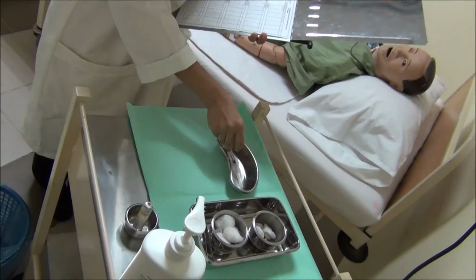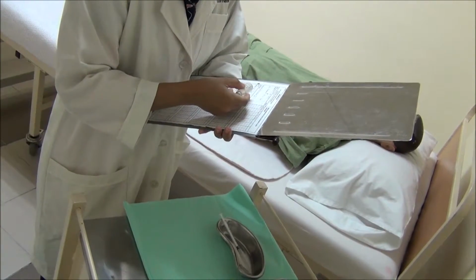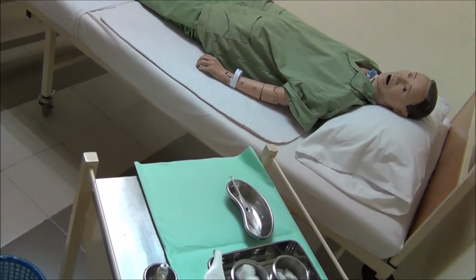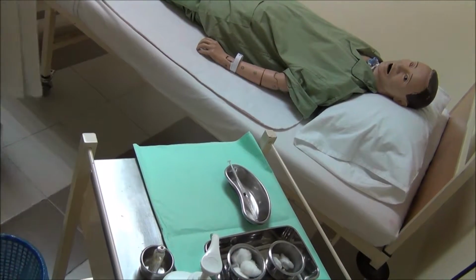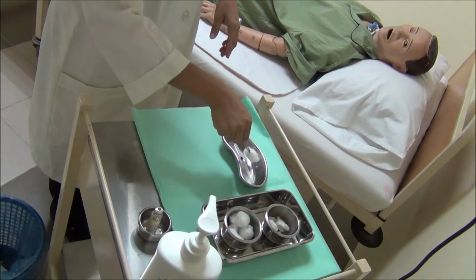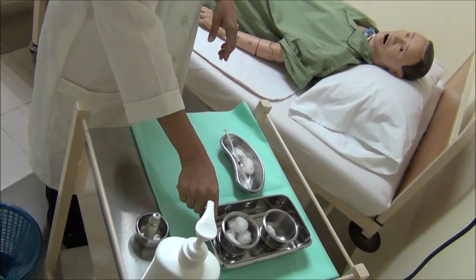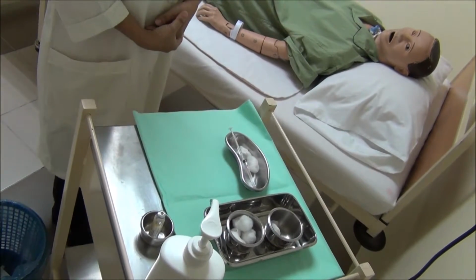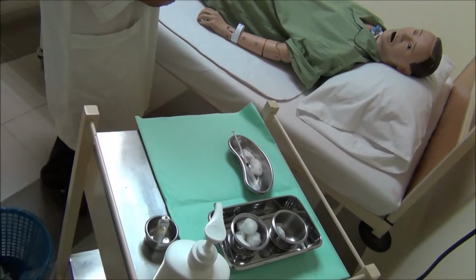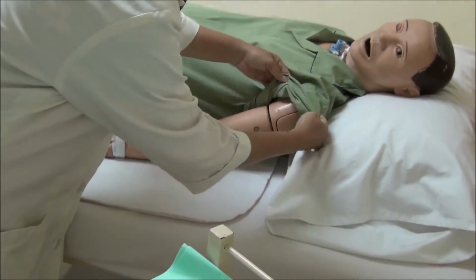Ensure there's privacy to maintain patient's dignity. Ensure patient is in a comfortable position. Don gloves if it is an infectious case. And now perform the check of medication, which you have seen her doing. Prepare a piece of alcohol swab and a dry swab. Locate the site accurately. Today she is going to perform at the deltoid.